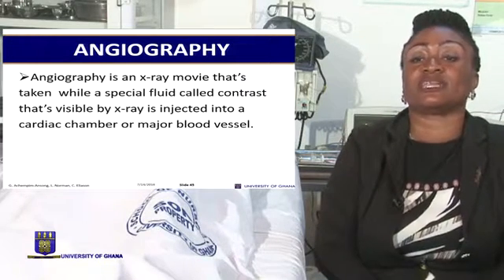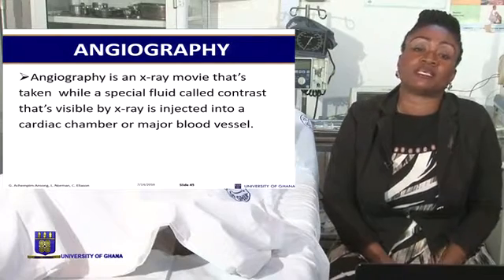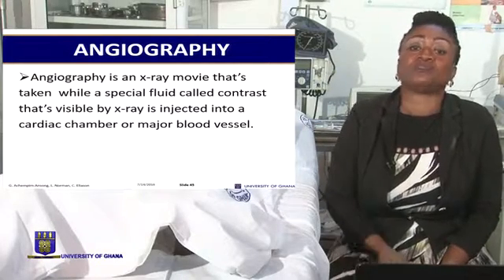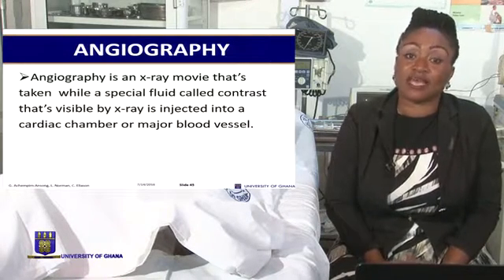Remember that with cardiac catheterization, we are targeting the heart chambers, even though we are going to pass through major vessels to the heart.